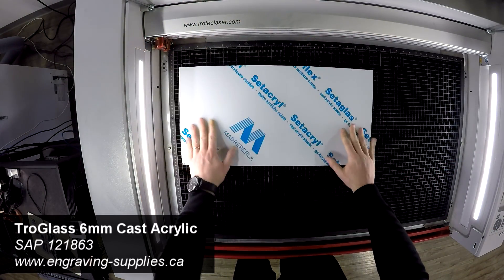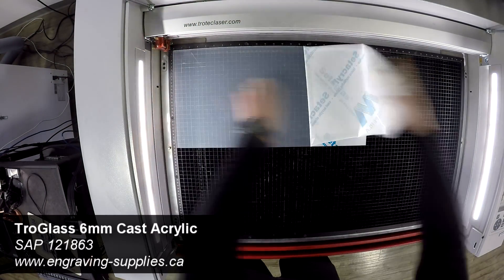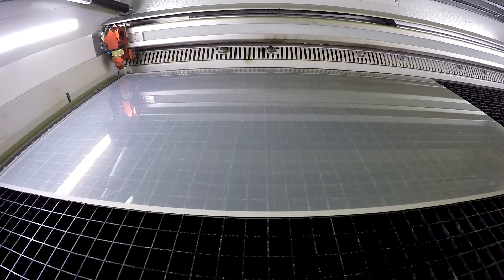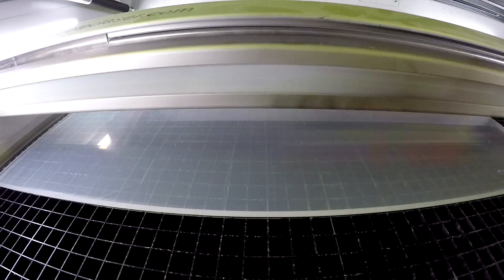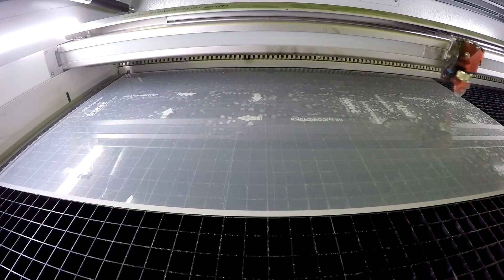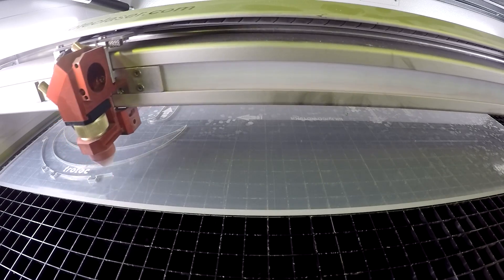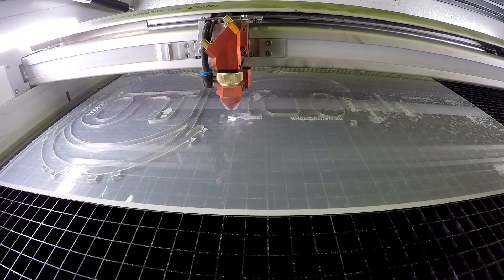We first place 6mm Trowglas cast acrylic into our Speedy 400 laser. These mask files are small enough to fit into a Ray Jet. We've made holes in the back of the mask file in case users need to tie them together. You can laser-cut foam for more comfort or adjust the file size to fit different head sizes.